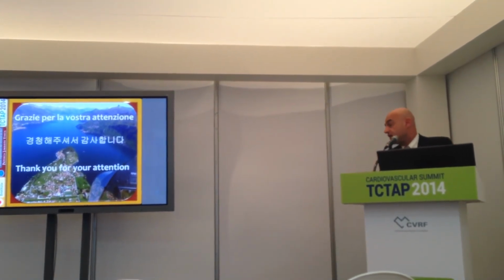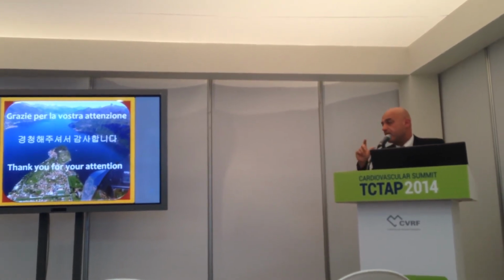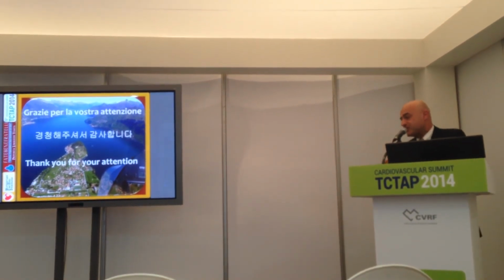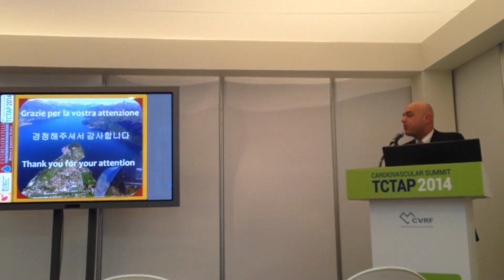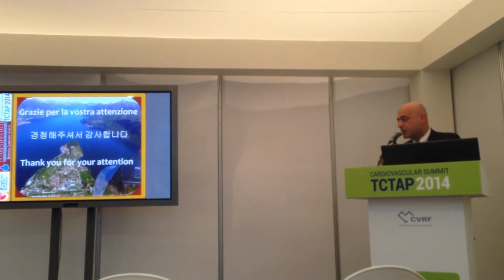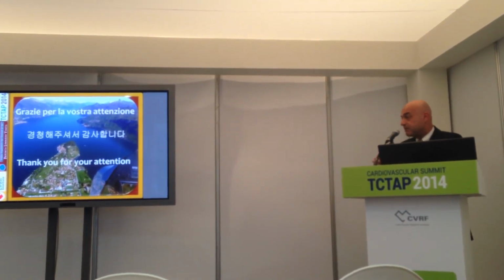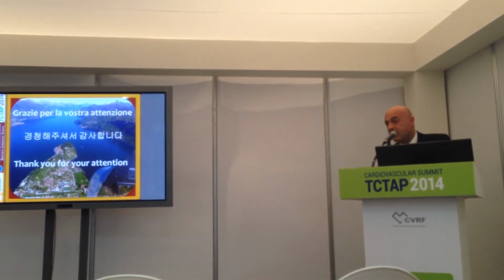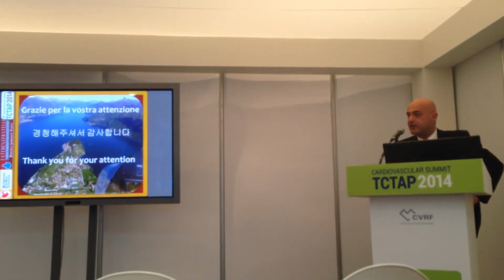Among the most important things are also the diameter of the vessel and the calcium of the side branch or main branch. If you have a very calcified main or side branch and you post-dilate, but still the image is not good and you don't have a good lumen, the Axxess is not opening, so it remains entrapped in the main or side branch where you put it. So you pull it back, the catheter goes inside, and you can dissect the left main. But the experience, okay, after that.